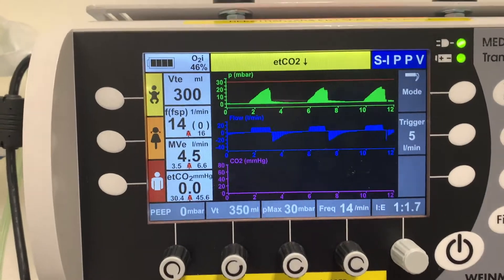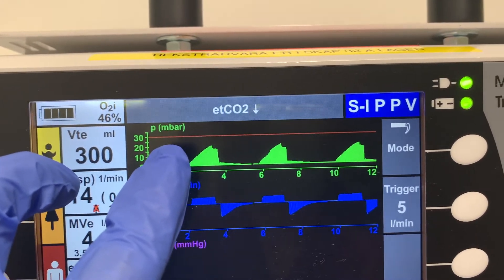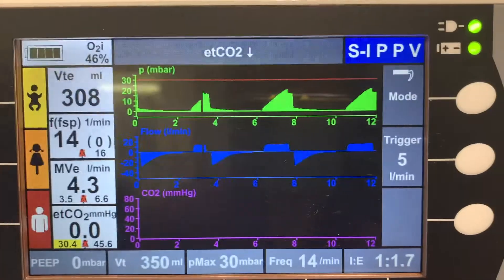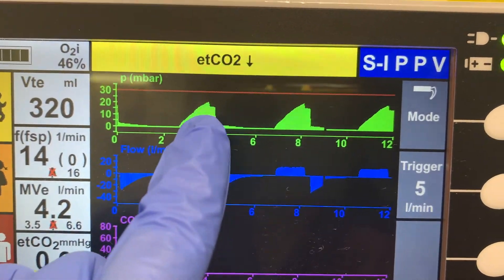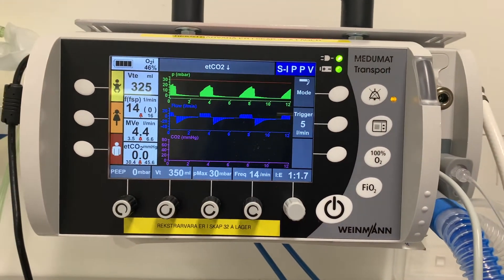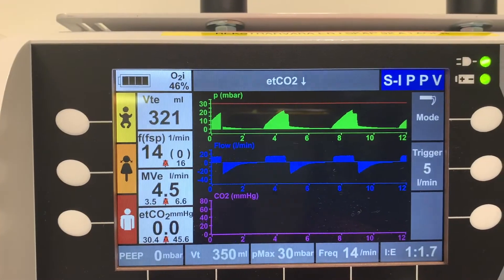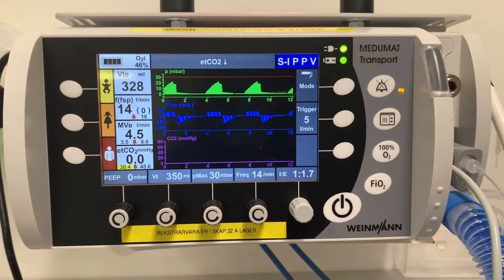On the screen you'll see the pressure waveform — a shark's fin shape — followed by a small decrease, which represents the plateau pressure. In this example, the peak pressure is about 20 and the plateau mark is around 15 to 17. We can roughly estimate that the plateau pressure is well below 30, so we're in the safe zone for this patient.